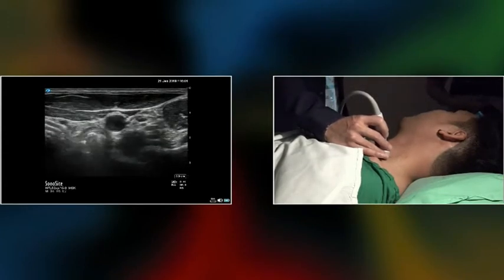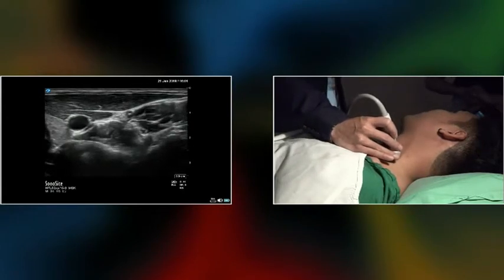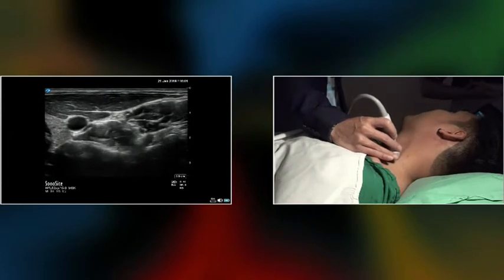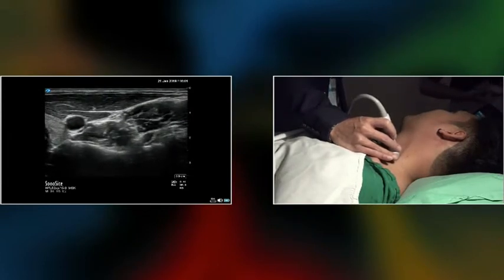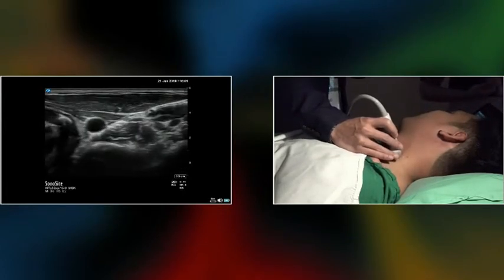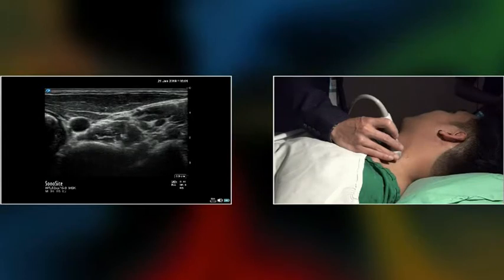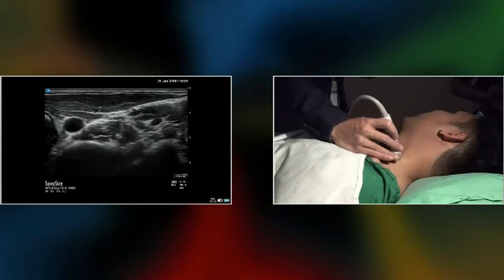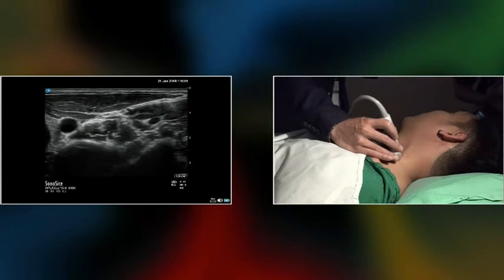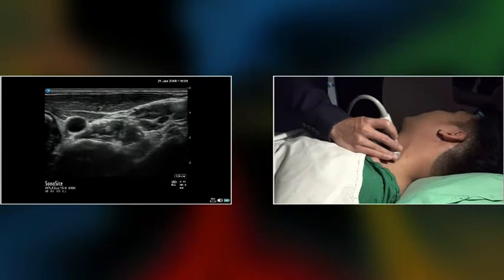This is the esophagus, and the muscle lateral to the esophagus is our target, which is the longus colli muscle. If you advance your needle too much, you may hit the esophagus, and the patient will probably get an infection. The target plane is the interfascial plane between the internal carotid artery and the longus colli muscle, which is the prevertebral fascia. The volume is probably 5 to 10 milliliters of 1% xylocaine. That is enough.